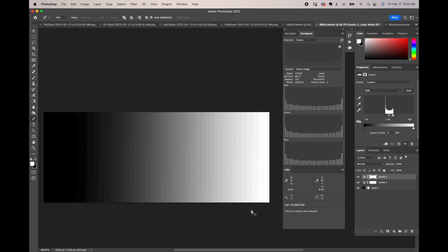So when you're doing images, say in the photography world, a lot of commercial photographers specifically shoot raw files and then process from there, because a raw file is a lossless file format. You can't save to it. It's always going to be a raw file that you start with. You can save your raw adjustments so it will reopen, but it's not going to degrade the file if you save it.